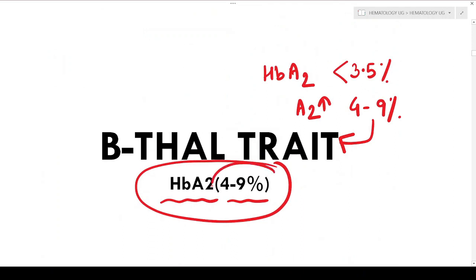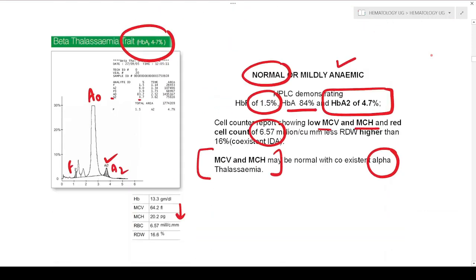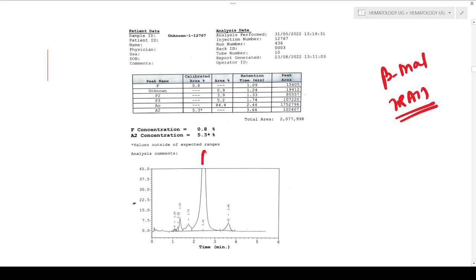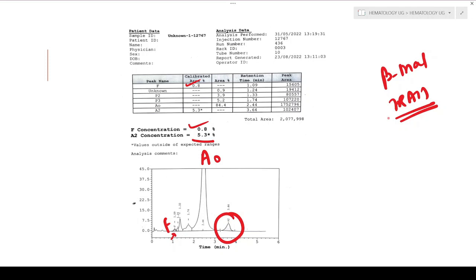The most important point in diagnosing beta thalassemia trait: HbA2 should be in the range of 4 to 9% — normally this level is less than 3.5%. This is another chart from our college — your classical beta thalassemia trait. This is your A0 chart, this is HbF normal at 0.8%, and the A2 concentration is approximately 5.3% — raised. This is your classical beta thalassemia trait.